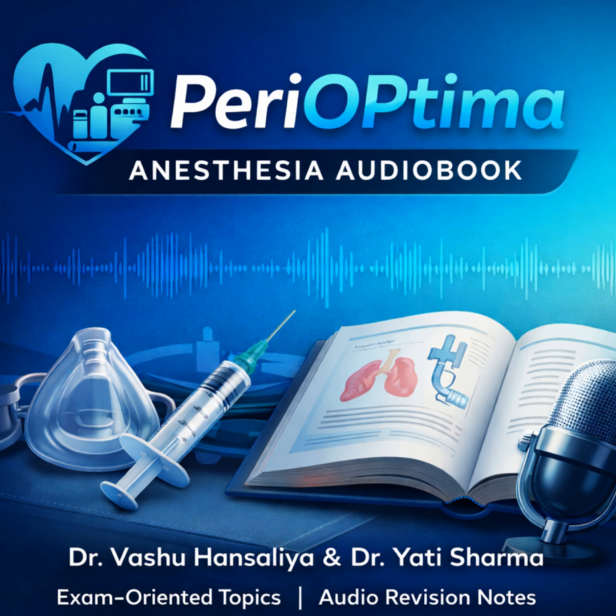Right, the functional section. We know SGDs are versatile, but we need to be able to list the clinical uses with authority. Start with the most common use, elective surgery. They are the routine choice for general anesthesia in diagnostic, superficial, or minor surgical cases, where the procedure is short and the patient has a low aspiration risk.